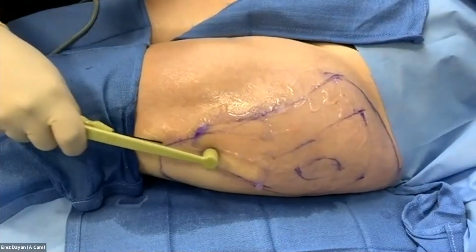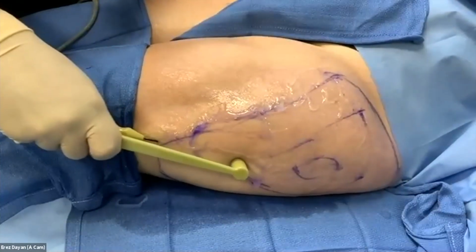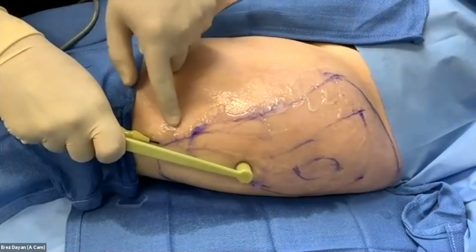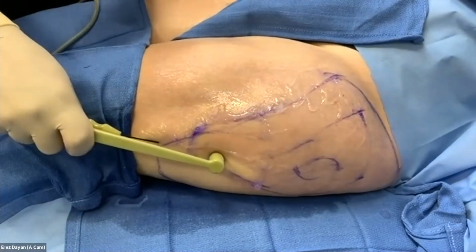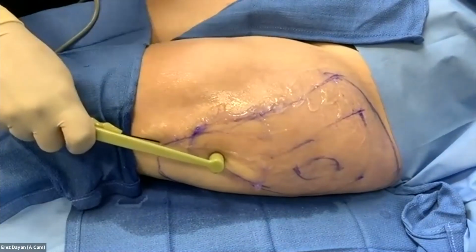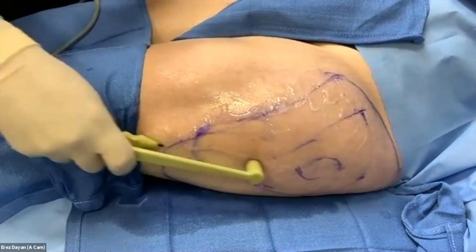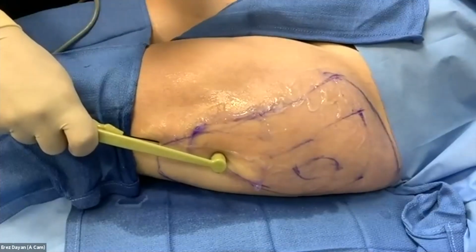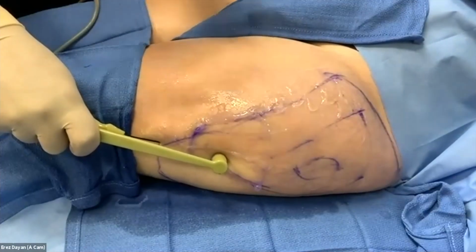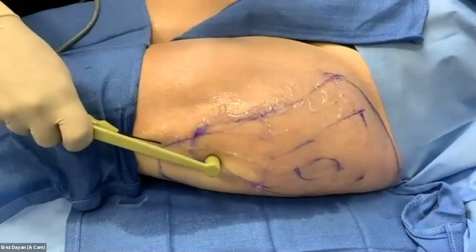So we're getting a nice even heating here, keeping my internal cannula down, just slow heating. The other thing you'll notice is I always stay about 1 centimeter away from the entry port because I don't want to heat it every time. What'll happen if you heat it every time is you'll get a little indentation there, and it's not ideal. Now the question was, can you overdo it? And I'll show you in the second PowerPoint. The device is smart, so once it hits target temperature, it's actually not firing, it's maintaining that temperature. So it's not consistently firing throughout the target temperature, it's just maintaining it. So you'll see target temperature is reached, and it just fires to keep that temperature up.